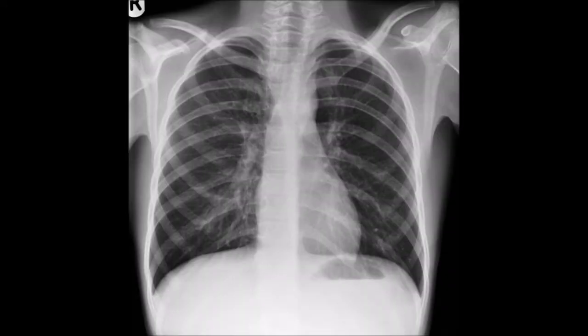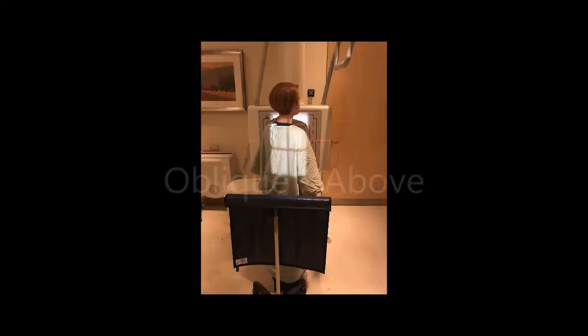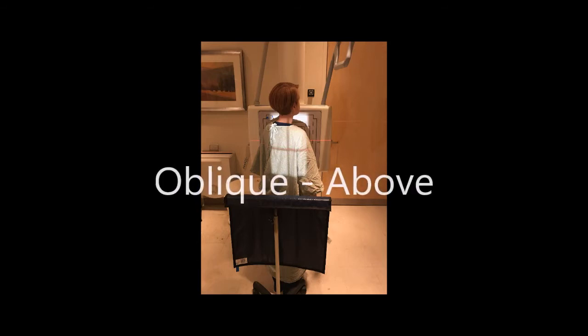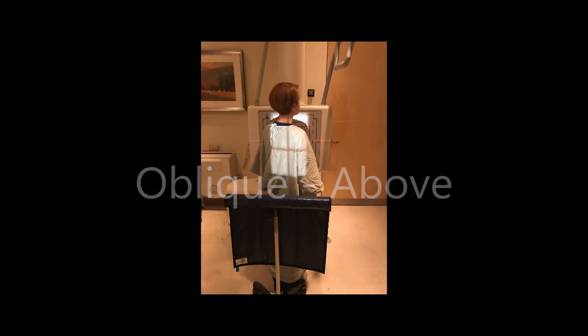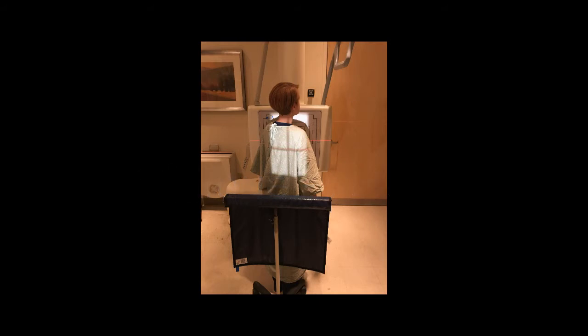Suspend respiration on inspiration. Next, we did the oblique. Since the patient is in PA, the affected side is away from the board. Always remember, PA away. Suspend respiration on inspiration.